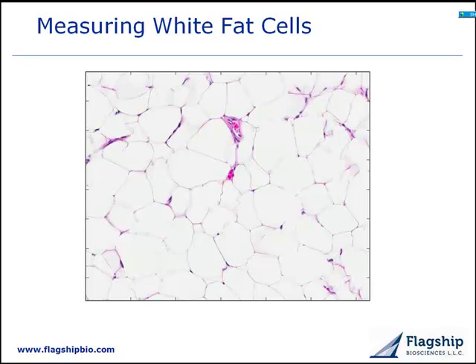It's important to note that in this fatty tissue, we're not really seeing fat, because the fat has been removed during processing — it is very soluble in the solvents used. To actually see the fat, we would need a frozen section stained with oil red O. However, frozen sections introduce a lot of artifact, and it's much easier to use formalin-fixed tissue for evaluation. From experience, we know that the empty spaces we see represent fat based on their appearance.